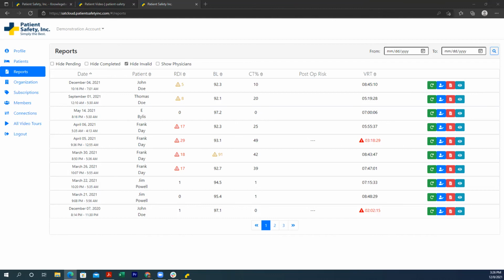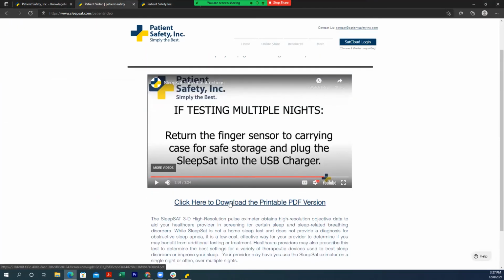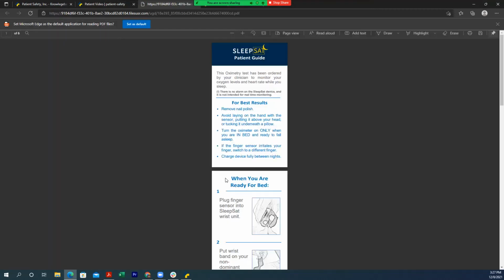The two that I hear about most are one that's considered a fast track titration, where if the patient has come back with a positive diagnosis for obstructive sleep apnea, the office may send the patient home with the oral appliance and have them, after they've had a week or two to adjust to the device, test multiple nights at different titration settings. So they may do a baseline first, titrate out slightly, record another test, titrate out slightly, record another test, and so on.